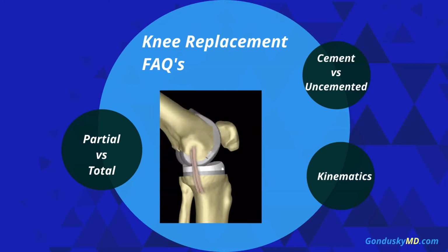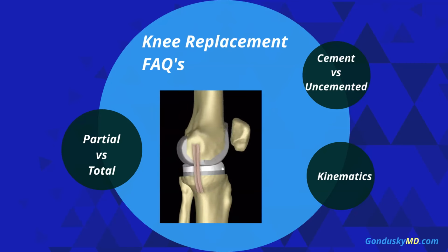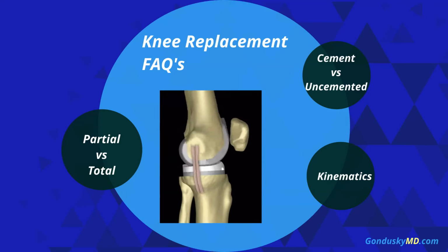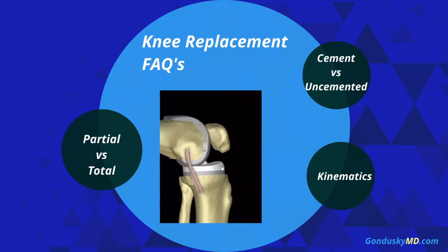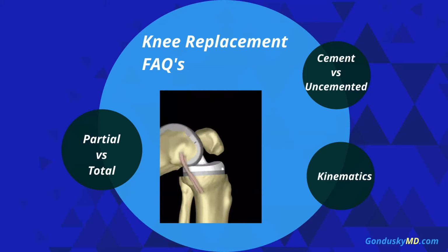These little subtle things really have a lot to do with our training, for instance, what kind of implants we used when we were learning how to do knee replacement and what we're comfortable with, that we tend to feel are best for people and best for us. And so that's where most of us gravitate to. But there are different companies that make knee replacement parts.